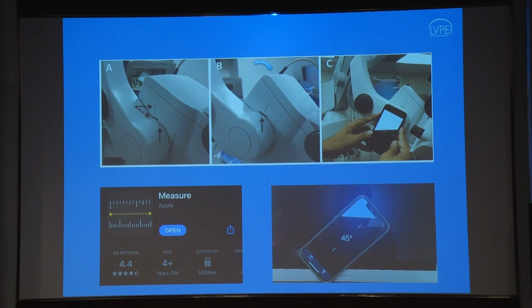And for surgeons who do MIGS procedures on a regular basis, you might not have to adjust it every time when you operate. So you can actually mark it on the microscope and then align these marking points every time you do the surgery, so that you don't have to keep adjusting it every time you take up the patient for surgery.